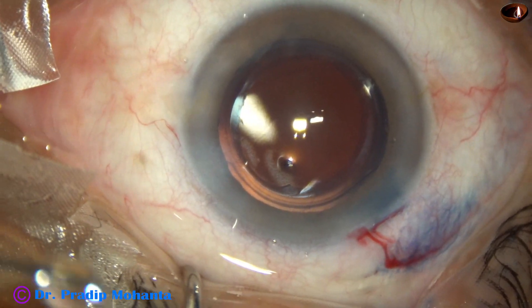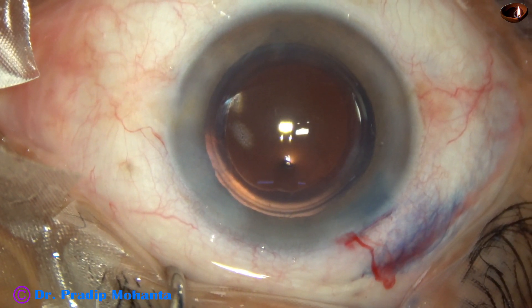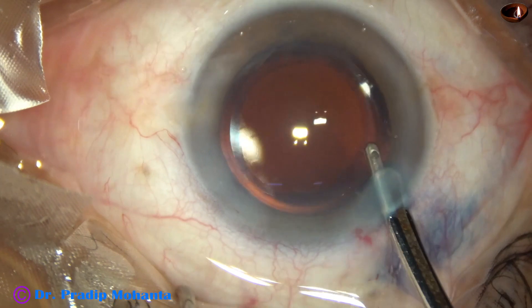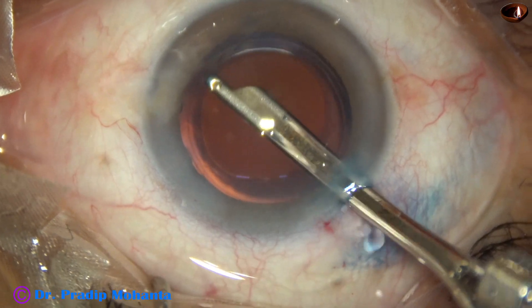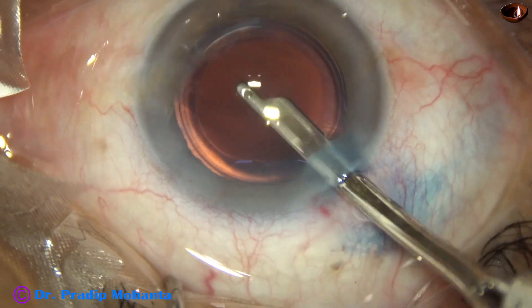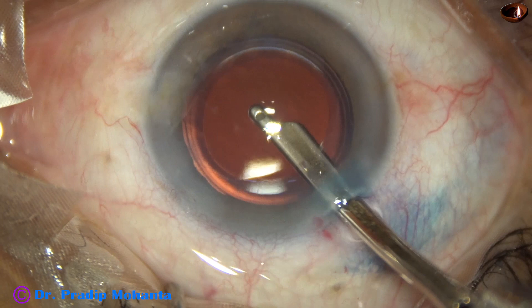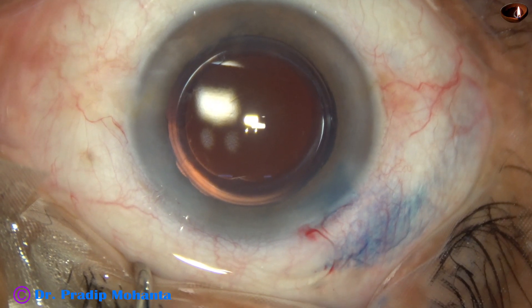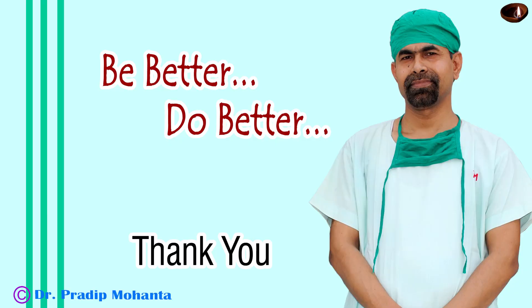The side port is closed by hydrating the corneal stroma. Then this is the final lavage of the anterior chamber. After a thorough lavage, the anterior chamber is nicely formed. The integrity of the wounds is checked with a cotton-tipped applicator. After that, few drops of moxifloxacin are applied and the case is concluded.